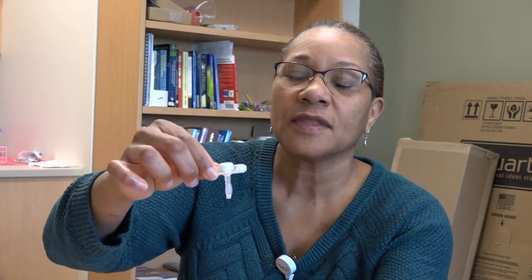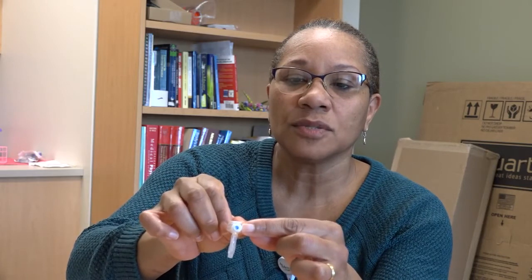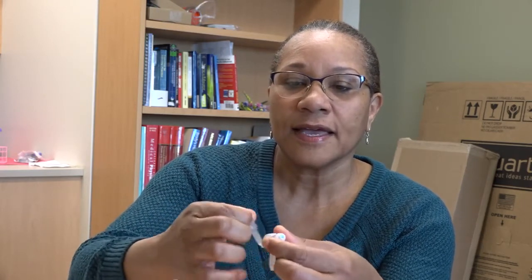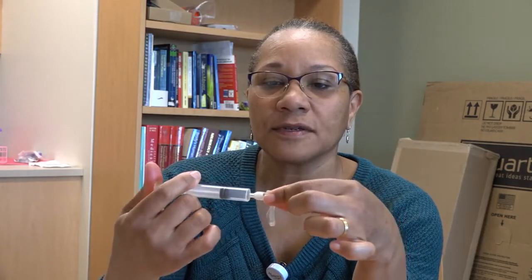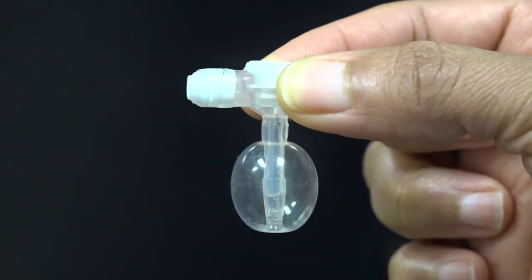Second thing I want to talk to you about is what the G-tube is and show you what it looks like. So this is the G-tube, okay? The parts to the G-tube, you have the retention balloon port, you have the feeding port, you have the feeding port cover, and we fill the retention balloon with water. For purposes of this education video, we're going to use air, but usually about 5 cc's, or milliliters, of water is what fills the balloon, and that's what holds the balloon in place inside the baby's stomach.